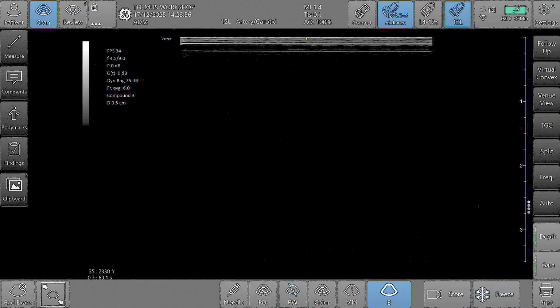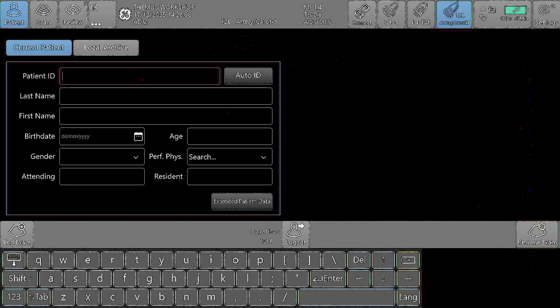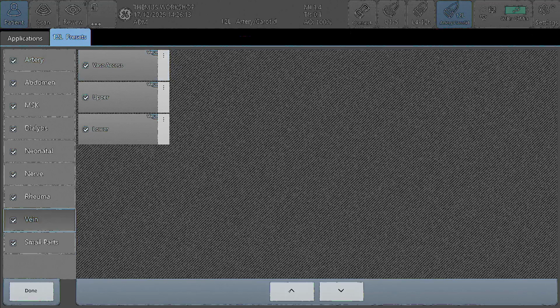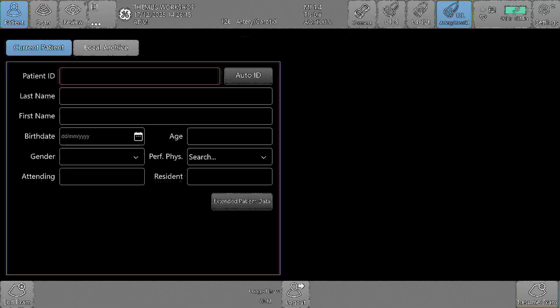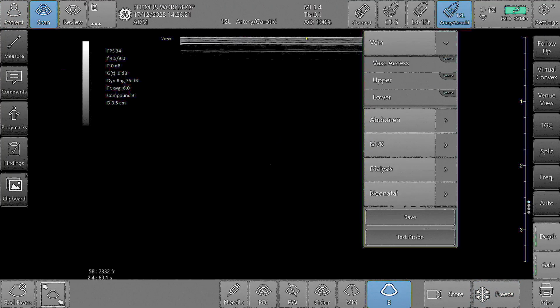If the patient is under positive ventilation, if possible, paralyze the patient, that would be much easier, right? Completely rely on positive ventilation. But if the patient is on positive ventilation and still has his own breathing, I think that is the same as spontaneous breathing, right?